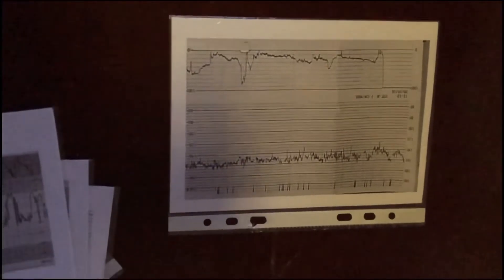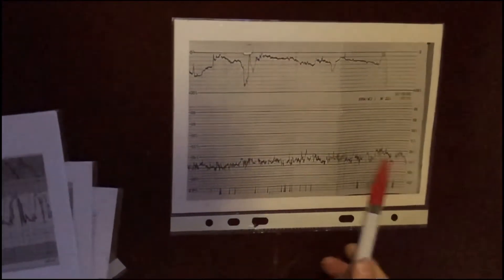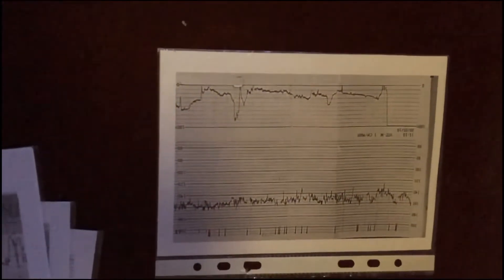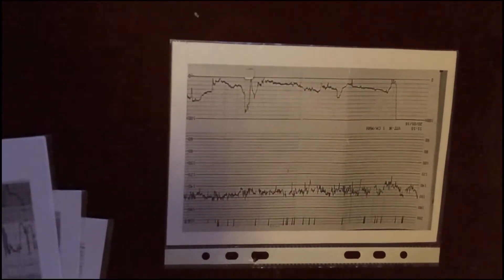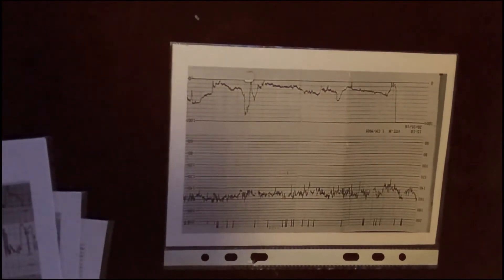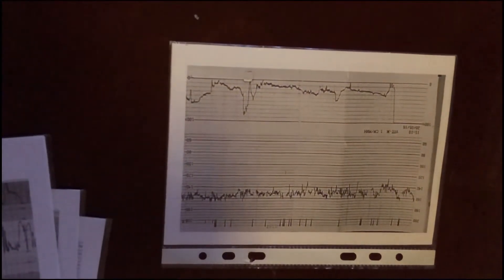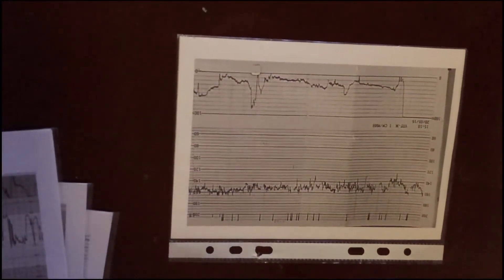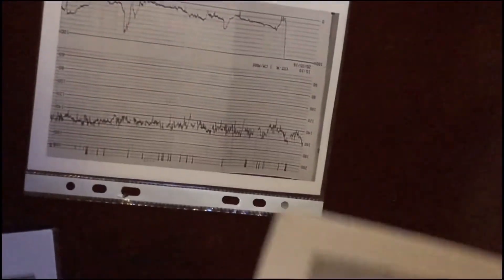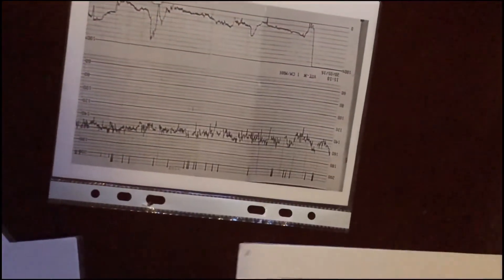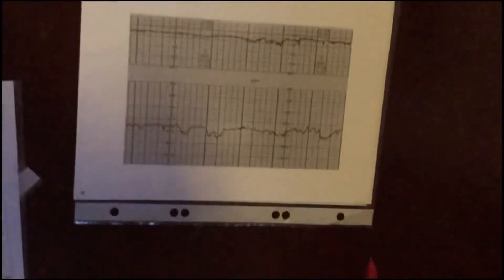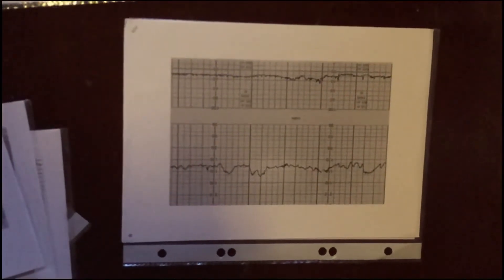Guys, on this CTG we see normal fetal heart rate, normal amplitude. We don't see late decelerations, monotonic rhythm, or sinusoidal rhythm. We don't see any signs of fetal distress — normal fetal condition. On this CTG, again, we don't see any signs of fetal distress.